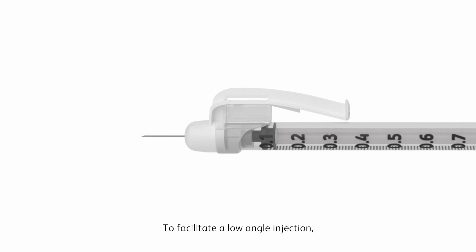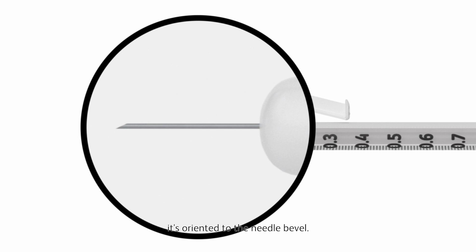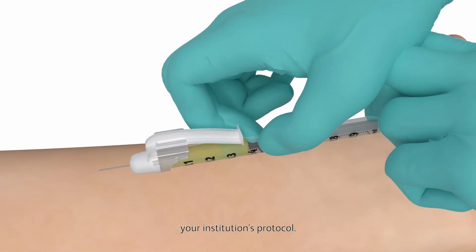To facilitate a low angle injection, rotate the safety arm so that it's oriented to the needle bevel. Administer the medication following your institution's protocol.